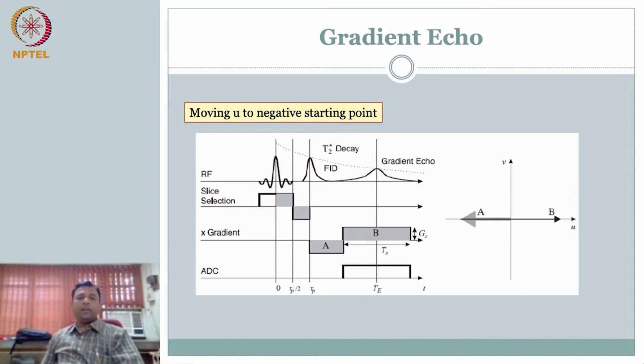Okay, so welcome back to the next session. We left it at a very nice point, right? In the previous video we left it at the end of gradient echo. What we were trying to do is we have a slice selection, we know how to encode the readout direction, or the x gradient, to obtain how the signal, where the signal is coming from along the x direction.